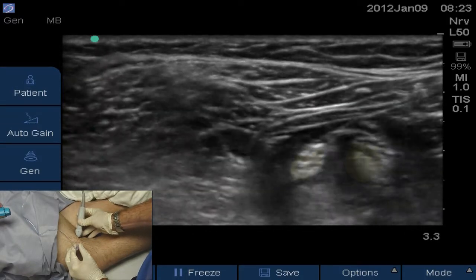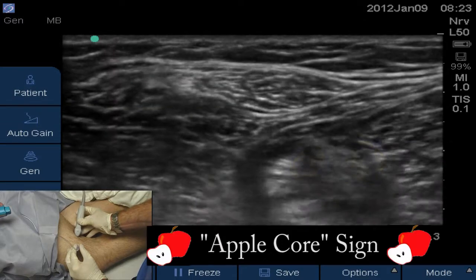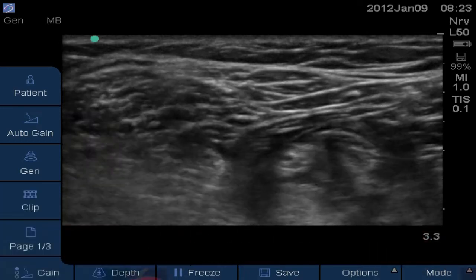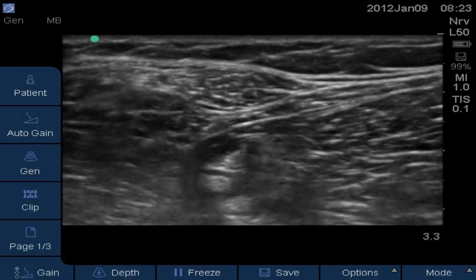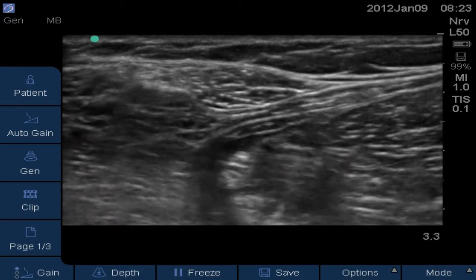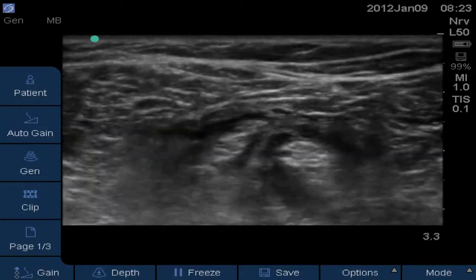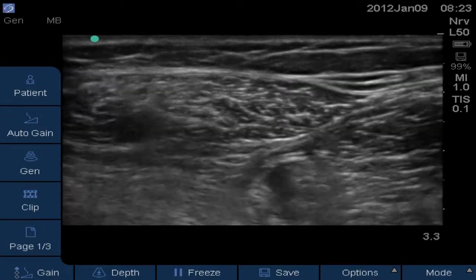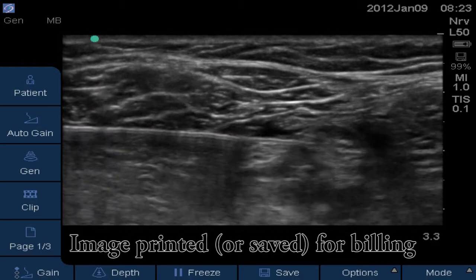Now notice that the nerves are completely separated from each other. It almost looks like a cross-section of an apple core — we call this the apple core sign. Going full screen: peroneal on the left, more laterally; tibial more medially. Scanning distally — see them separate. Scanning proximally, you have to go quite a bit higher than where we injected to see them come together again. So our local anesthesia really did separate them. We'll get a picture with that needle and those nerves in it.